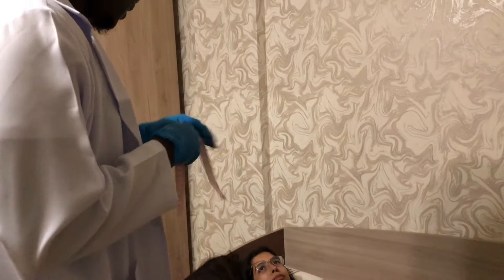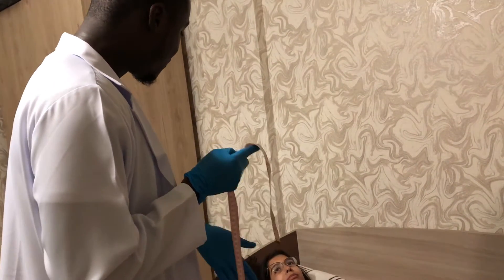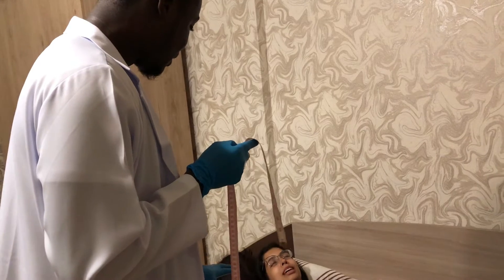Hello madam, how are you doing today? So I'm about to put a compression stocking on your leg, but before that I would have to measure your leg to know if the size is okay. Are you okay with that?